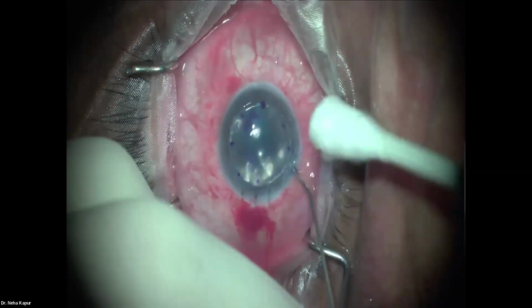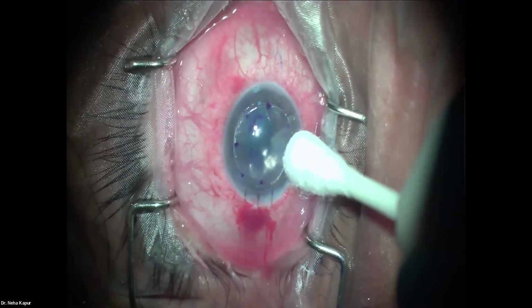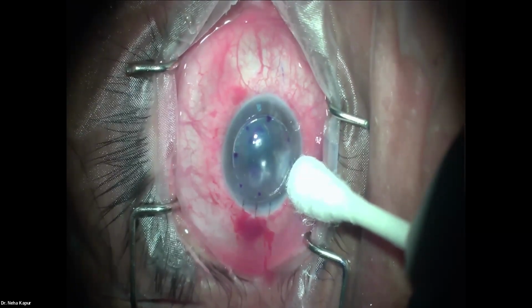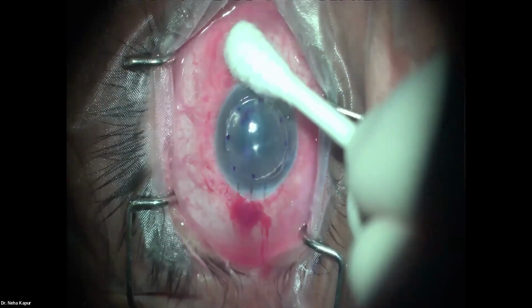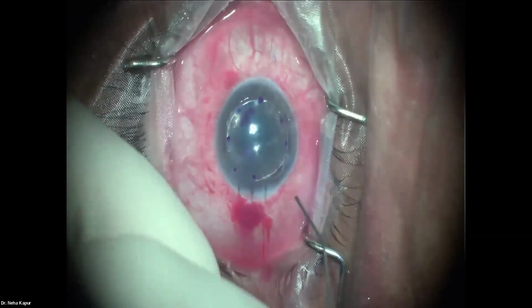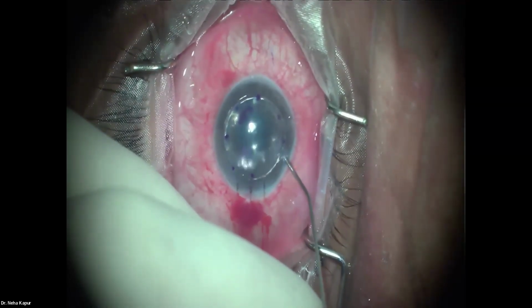The next question is, isn't blood in the eye causing any other problem? Technically blood has fibrin, so it can even allow the graft to stick. But fibrin can also cause other issues, with the graft sticking to the fibrin instead. So it can cause endothelial cell loss also. As much as possible, blood should be avoided in the eye.